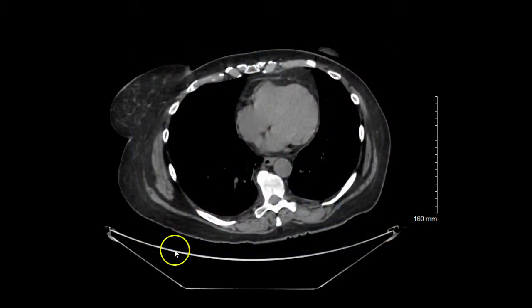Again, always remember that 0 is the baseline, corresponds to water. So if those densities are more dense than water, it'll have a positive value, or less dense than water, it'll have a negative value. I think as we go through these ideas, the concepts will really be reiterated quite well. So we'll get started.